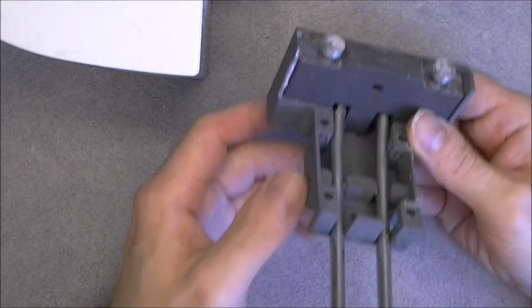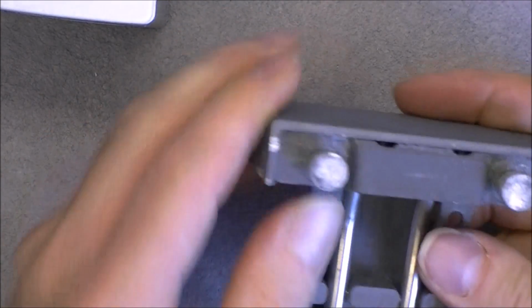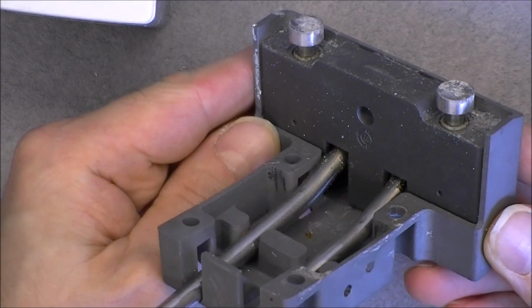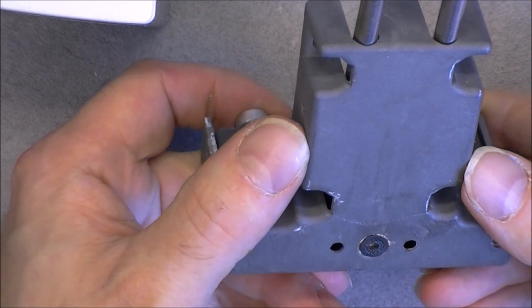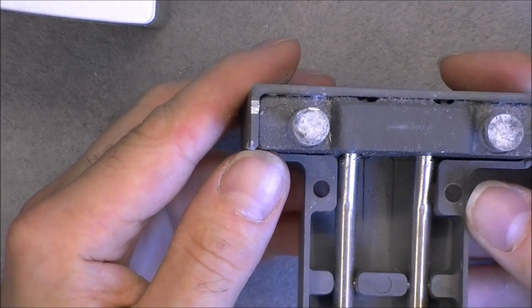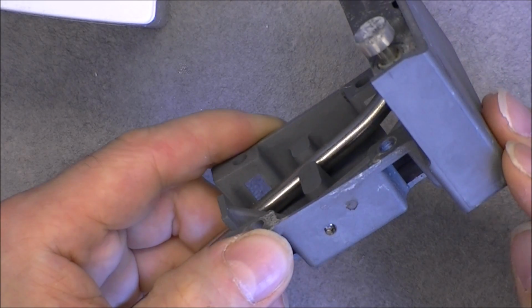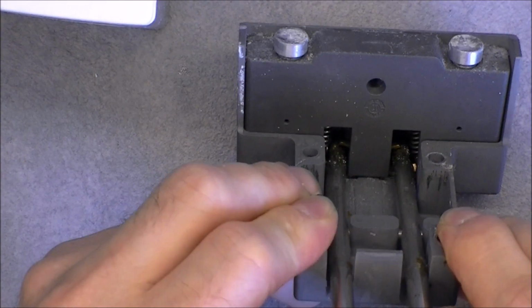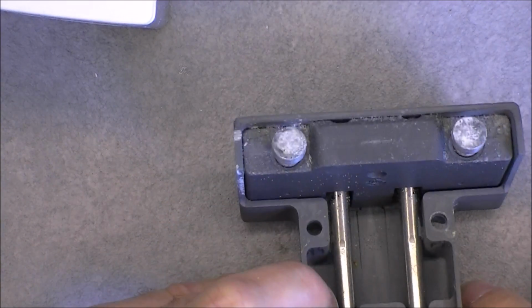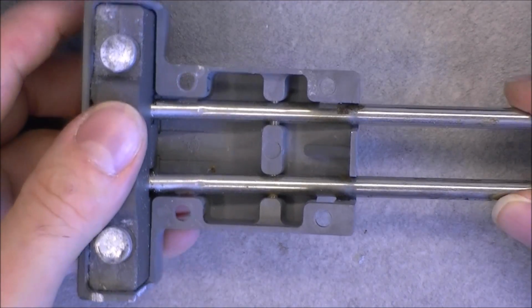Okay, so this thing, date code of 2007 here. It is all in die-cast metal. Seems a little bit heavy to be aluminium, not sure what it is exactly. And if I want to take it apart, I need to remove this pin here, which is probably very, very stuck inside. So we must have, yes, some springs action going on here, and it is all. No part number, sadly, so I cannot check the price of this thing on the parts broker website.